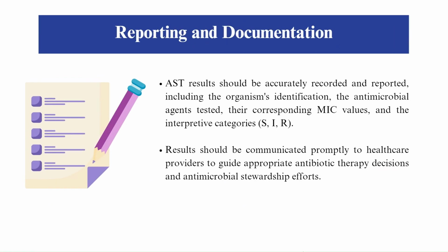AST results should be accurately recorded and reported, including the organism's identification, the antimicrobial agents tested, their corresponding MIC values, and the interpretive categories, sensitive, intermediate, resistant. Results should be communicated promptly to healthcare providers to guide appropriate antibiotic therapy decisions and antimicrobial stewardship efforts.